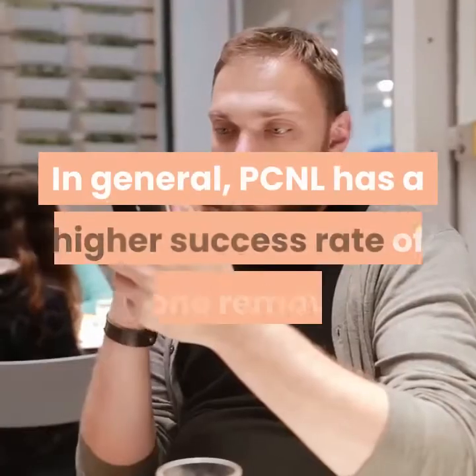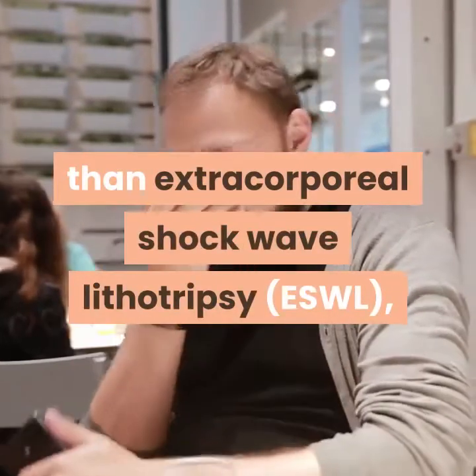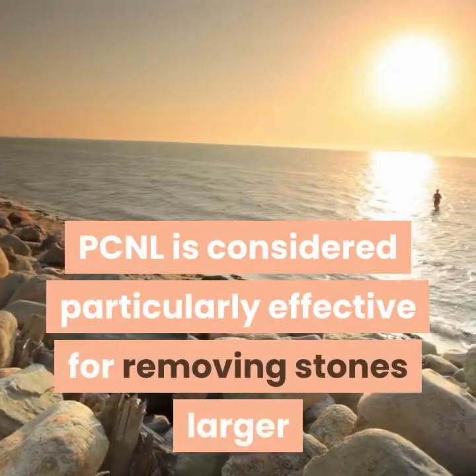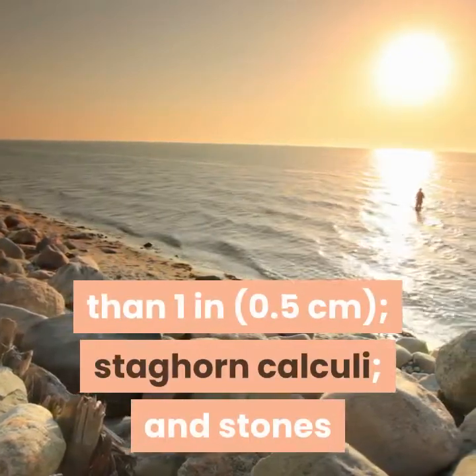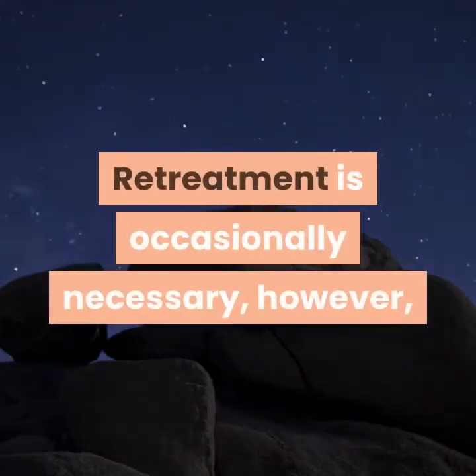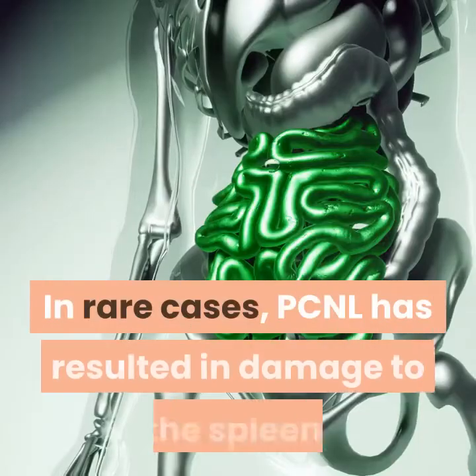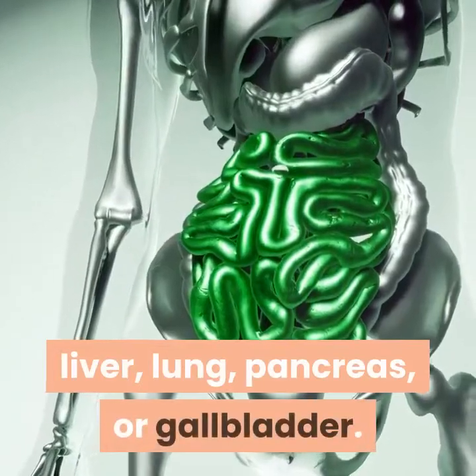In general, PCNL has a higher success rate of stone removal than extracorporeal shock wave lithotripsy (ESWL), which is described below. PCNL is considered particularly effective for removing stones larger than 1 in (2.5 cm), staghorn calculi, and stones that have remained in the body longer than 4 weeks. Retreatment is occasionally necessary, however, in cases involving very large stones. Injury to surrounding organs. In rare cases, PCNL has resulted in damage to the spleen, liver, lung, pancreas, or gallbladder.